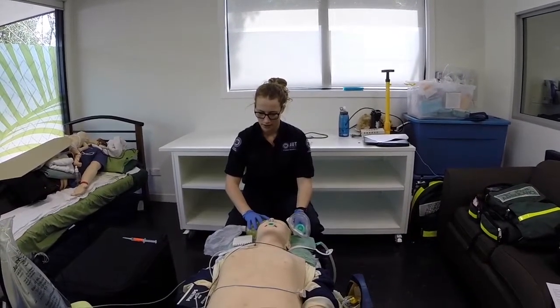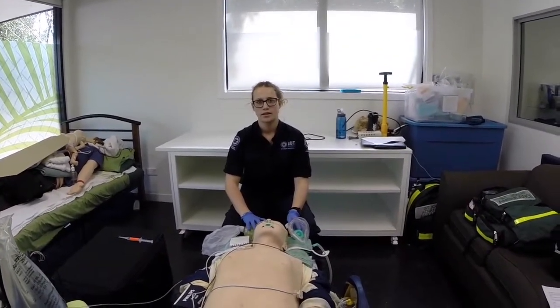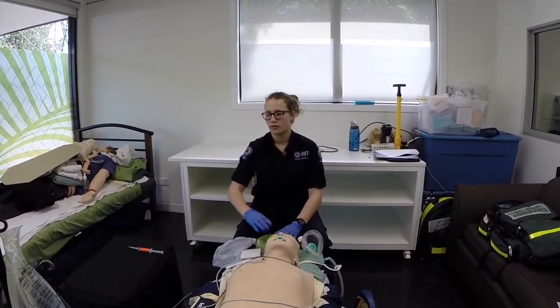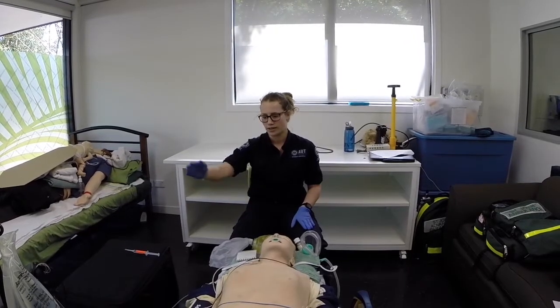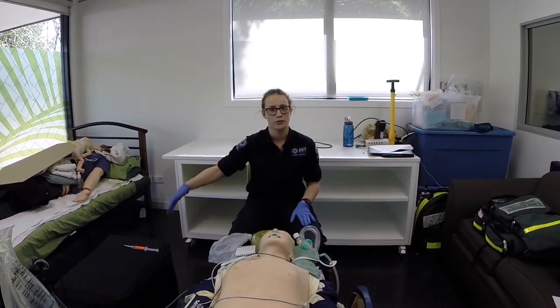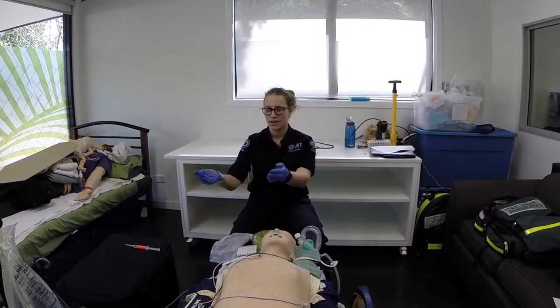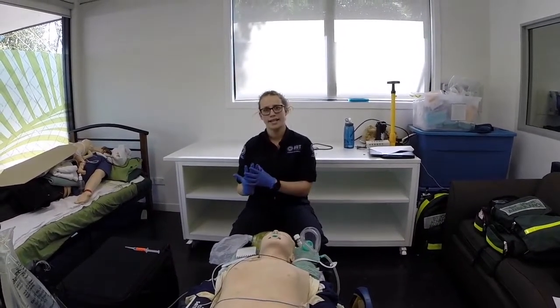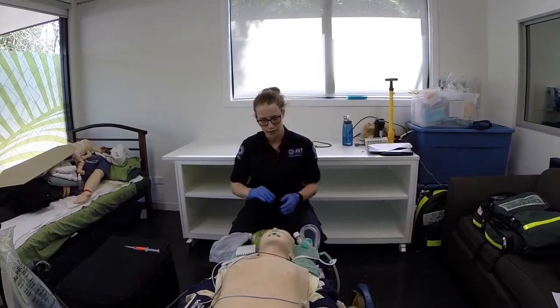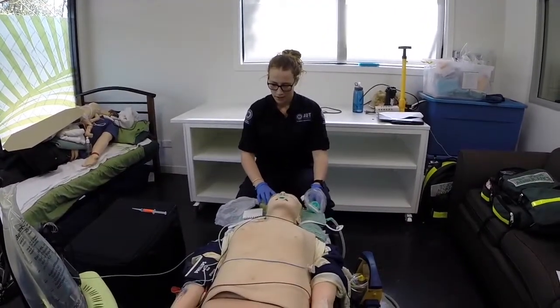Position the monitor so that it can be seen, leaving space to the right of the patient's head for intubation roll. So we've got the monitor facing me. I'm placed in the dicky seat. It is on the second stretcher provided in the ambulance. It is facing so that my offsider can also see it, and also the RSI officer can see it when he arrives.